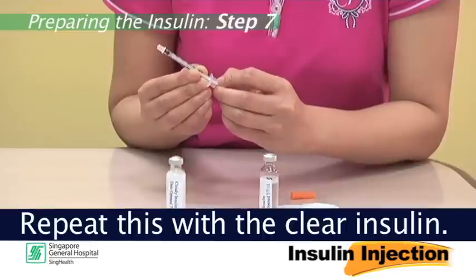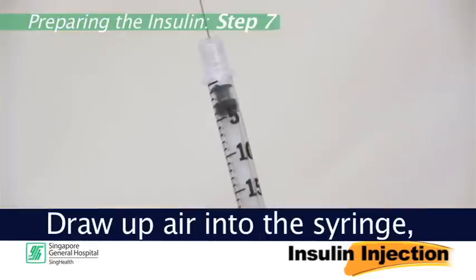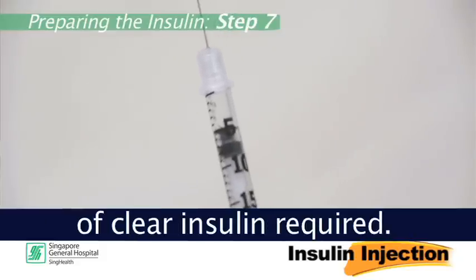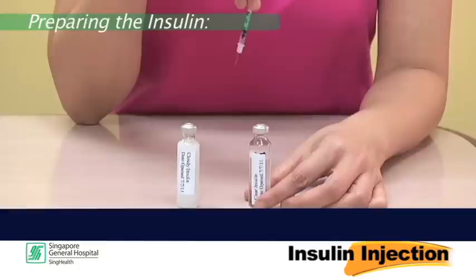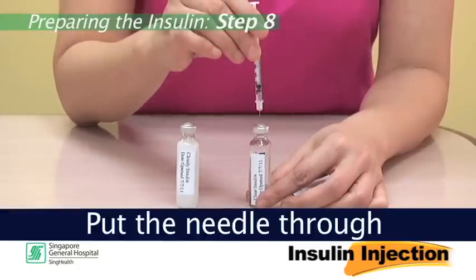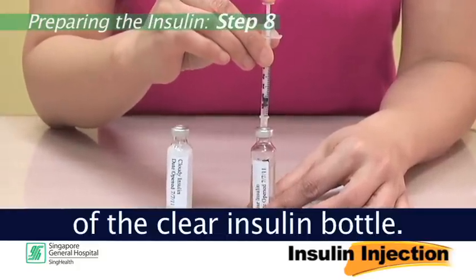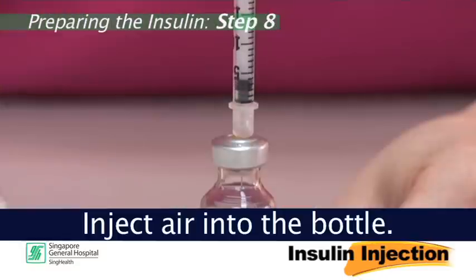Step 7: Repeat this with the clear insulin. Draw up air into the syringe equivalent to the dosage of clear insulin required. Step 8: Put the needle through the rubber stopper of the clear insulin bottle and inject air into the bottle.